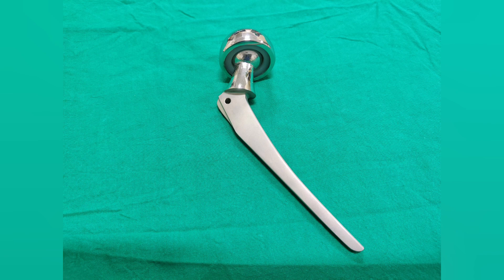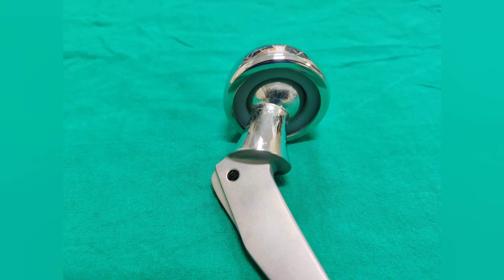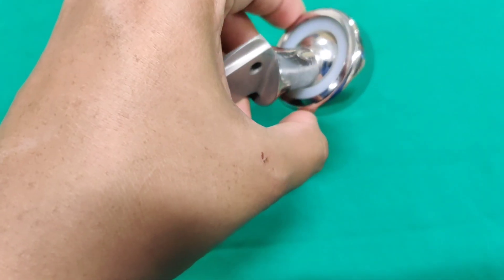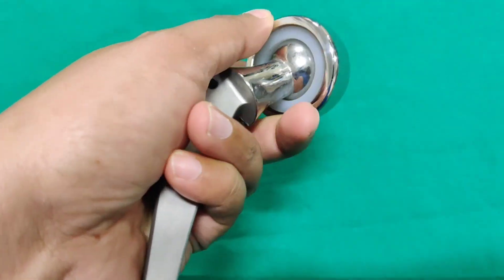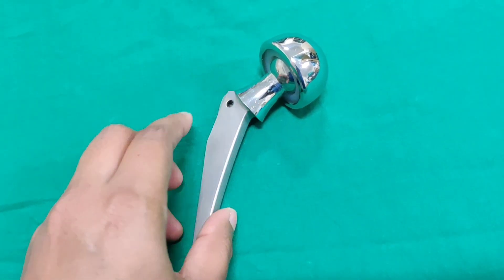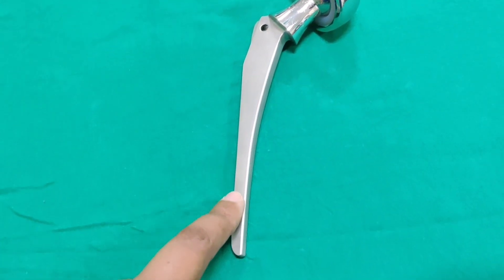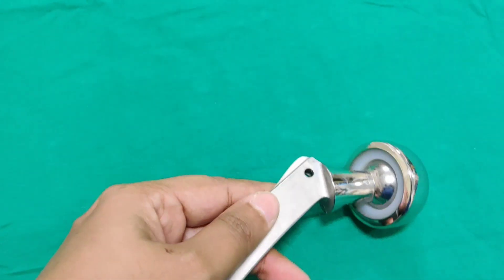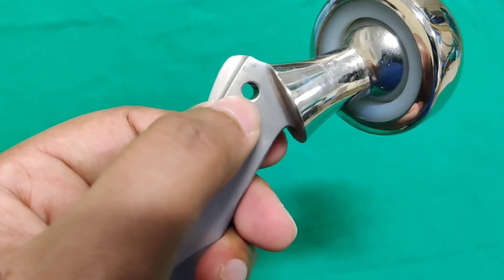Next is the bipolar prosthesis, also known as the Thalvarkas bipolar prosthesis. The parts are a head within a head — it has an outer metallic head lined by polyethylene, and a smaller metallic head inside. There is a neck and collar; the collar sits over the calcar. The stem is smooth and tapered, and there is a hole in the proximal part of the stem for anteversion maintenance and implant removal.